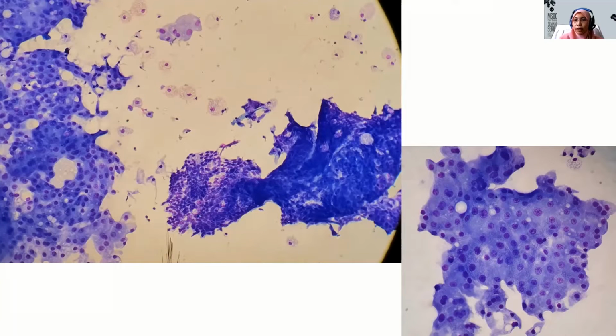And if you can appreciate, there are myoepithelial cells, the smaller, darker cells here and there within the cell clusters, and here are foamy histiocytes. So there is evidence of cystic changes. That's why in ultrasound, it shows cystic features.